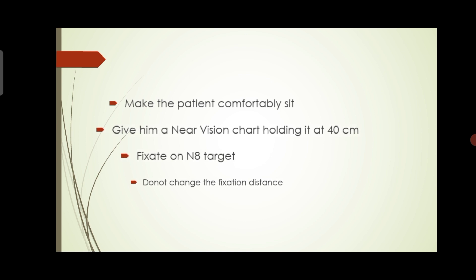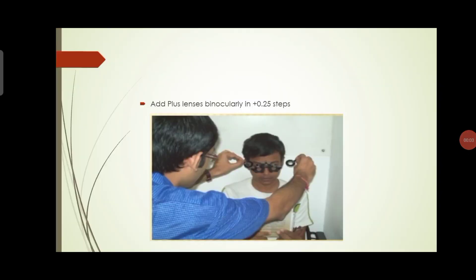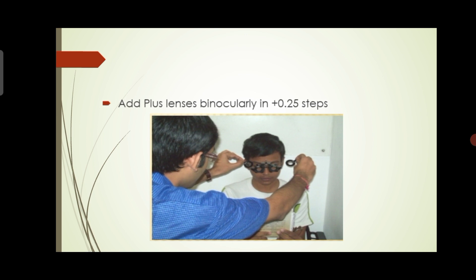Now add plus lenses binocularly in +0.25 steps. You can see how the examiner places the plus lenses binocularly. Tell the patient to look at and fix on the N8 target. Once the patient reports it is clear after adding +0.25, add another +0.25, making it +0.50 total.